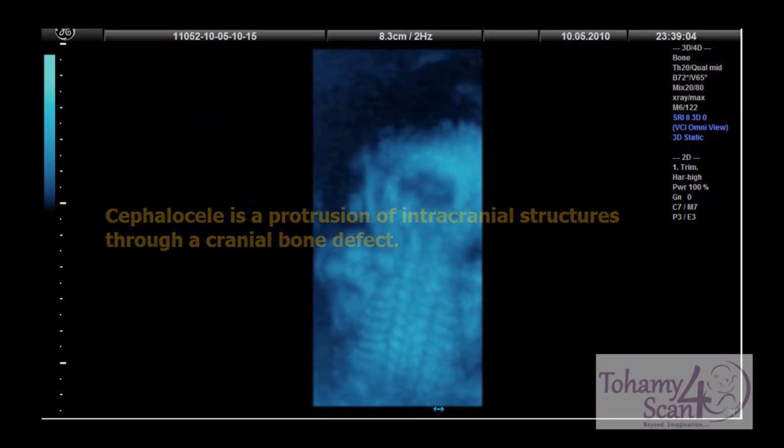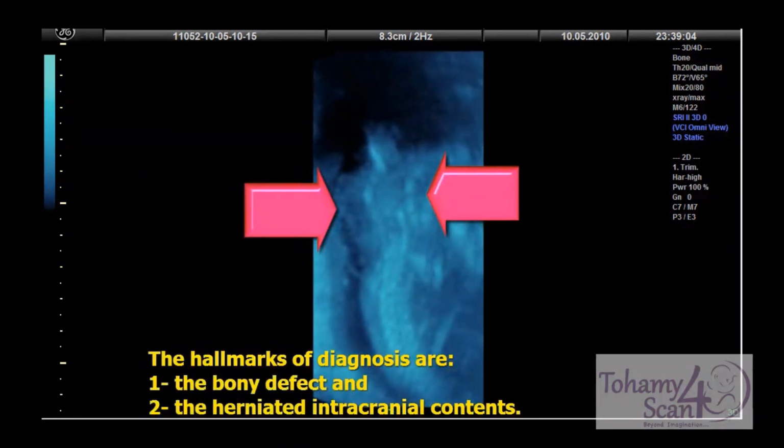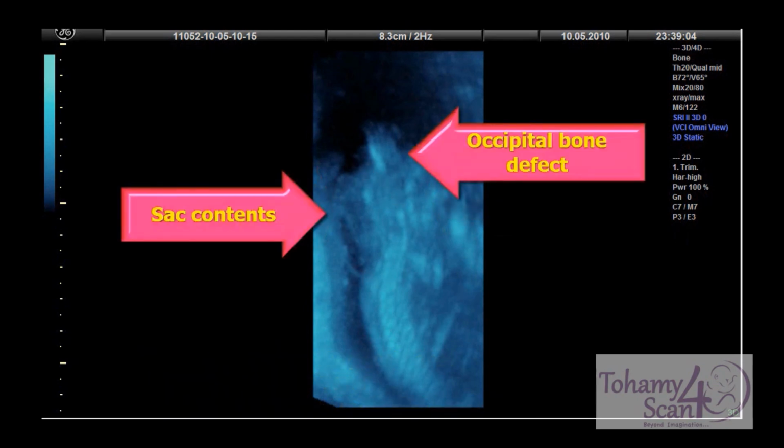I encourage you to pay close attention to the imaging examples and explanations, as they will bring clarity to how this condition is diagnosed and managed in real-world clinical settings. Let's take a look at the video.